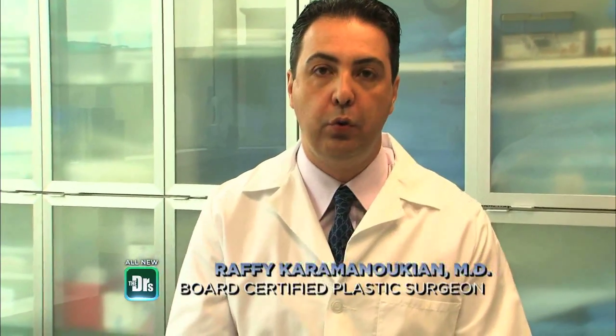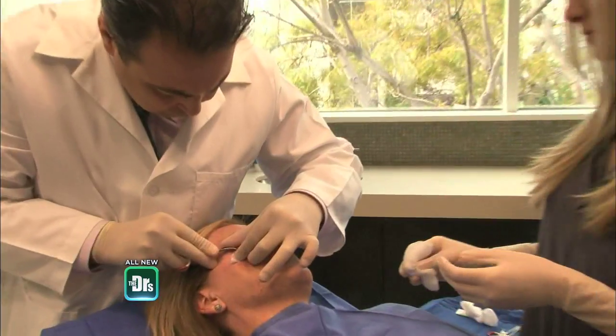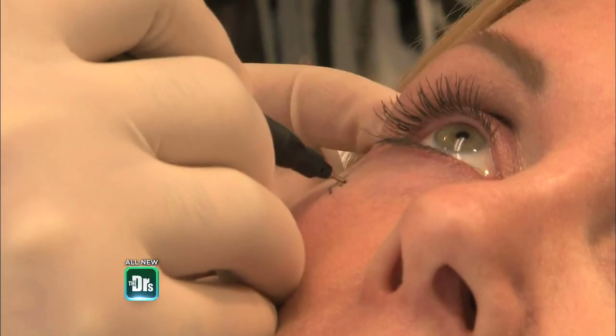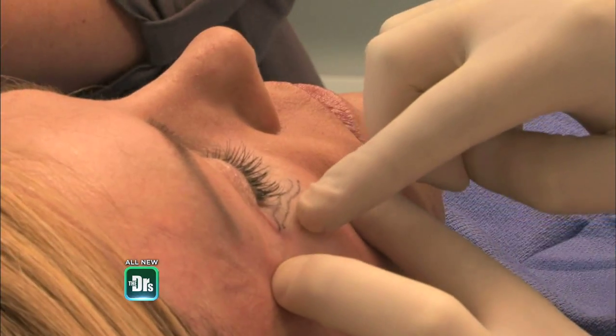Well, we all have veins on different parts of our body. In Jamie's case, she has an unusual condition where the vein on the lower eyelid is big and bulging, making it look black and blue. Treating eyelid veins is a little bit different than other areas of the body. The approach we're taking for Jamie's vein is to actually tie off the ends of the vein and actually remove them permanently. The first step is to actually mark out or map out the vein using a surface marker.